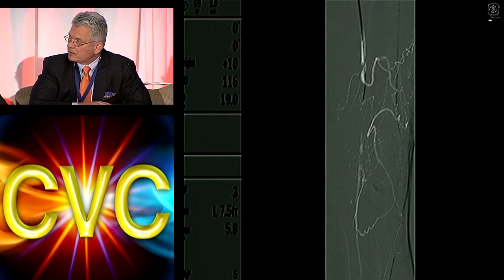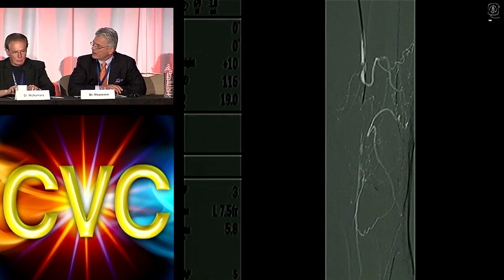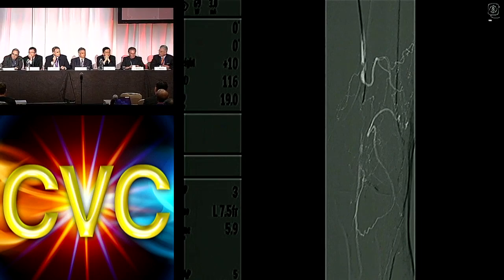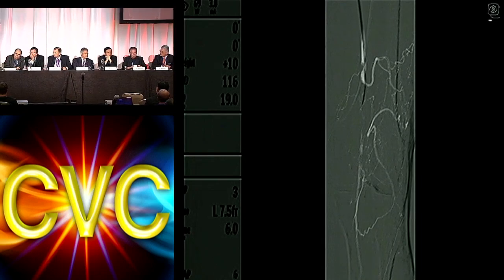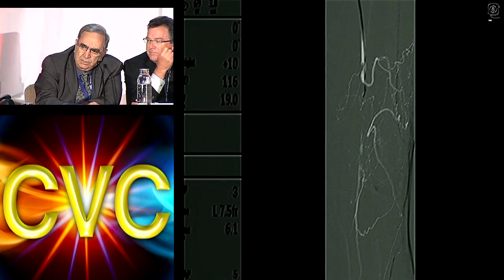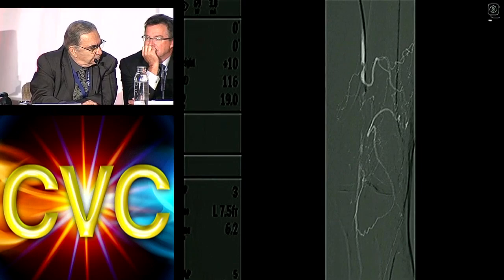Yeah, he has very severe claudication. He can barely get across the room, and it hasn't gotten better. He's been trying to walk through it for the last year and not getting anywhere. You haven't crossed that lesion as yet, so we would, okay, start working on it while you're talking. Okay. Go ahead. This is Craig.